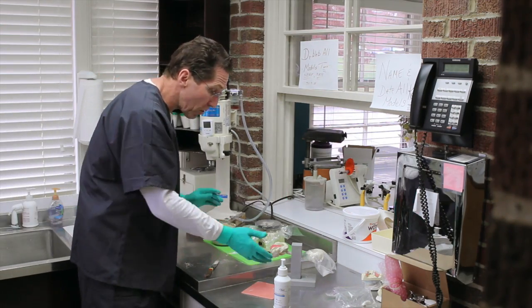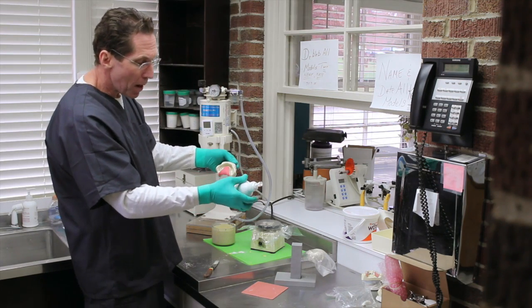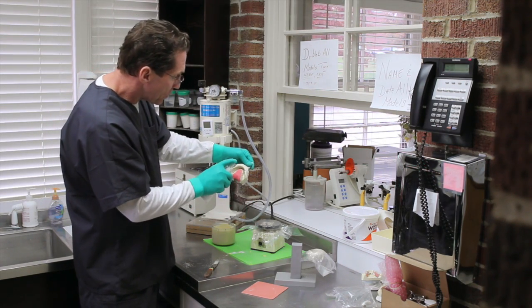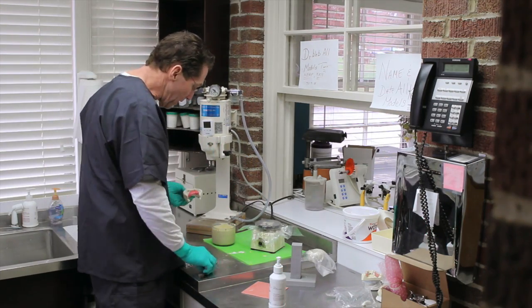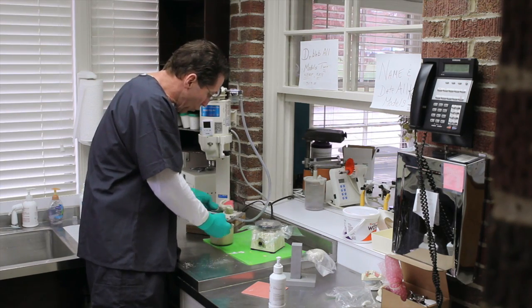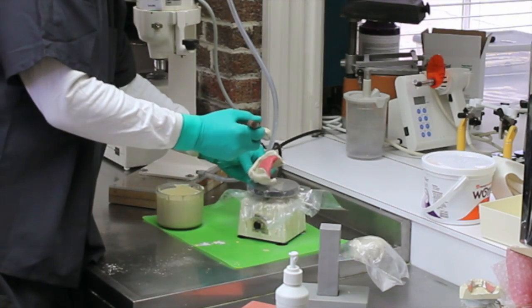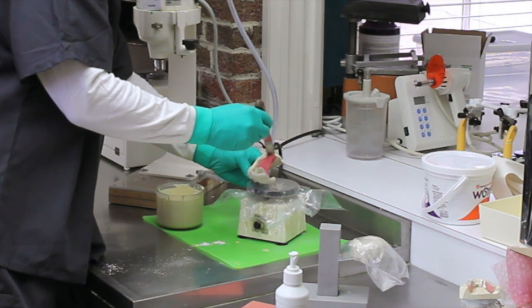Now, before actually pouring the cast, I do like to give it one or two shots of the debubblizer, the curd debubblizer, which is a surfactant that prevents any bubbles. We'll turn that off now. And my personal preference for pouring impressions, I like to start at one corner, one posterior corner, and I like to watch the stone advance.